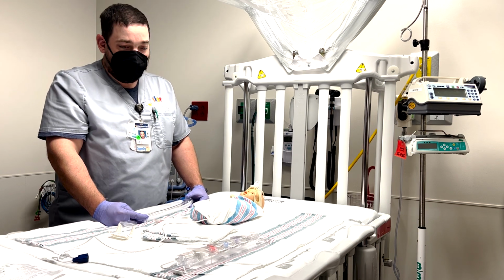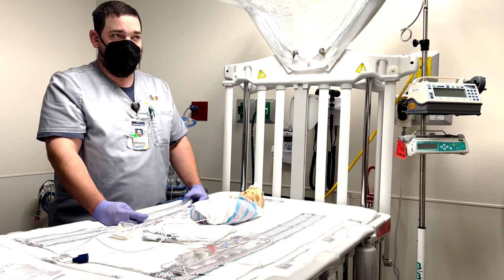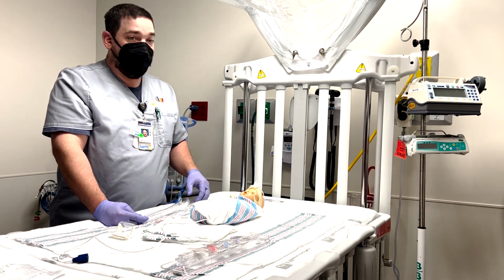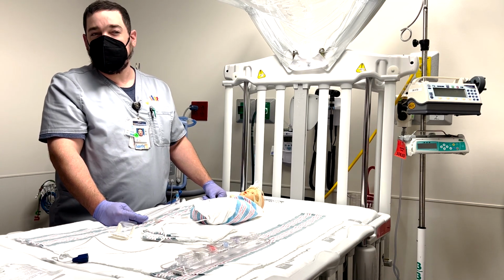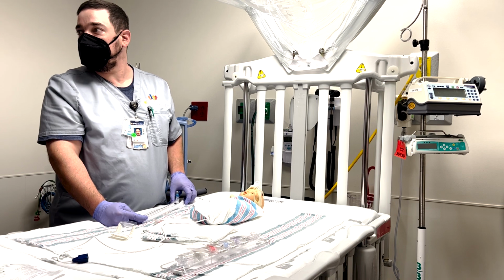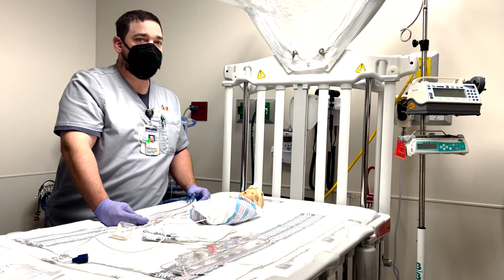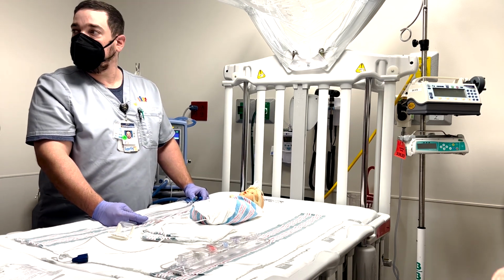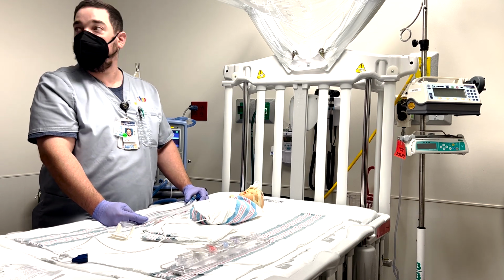I will say you don't see a whole lot. The younger the baby, I would say the better they do, because again they adapt a lot faster. But the older the kid, the general tendency to move more towards Precedex is more common, I'll say. Not all the time, but more common. In my experience. I also do not harbor MD behind my name.